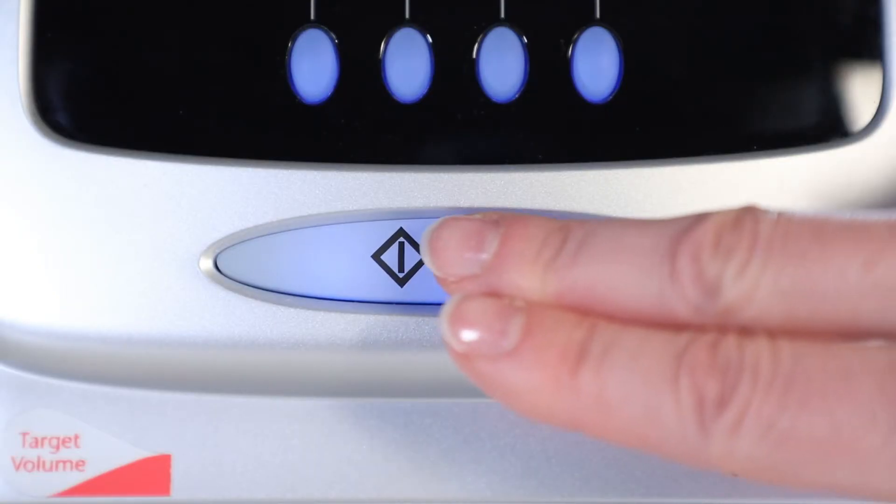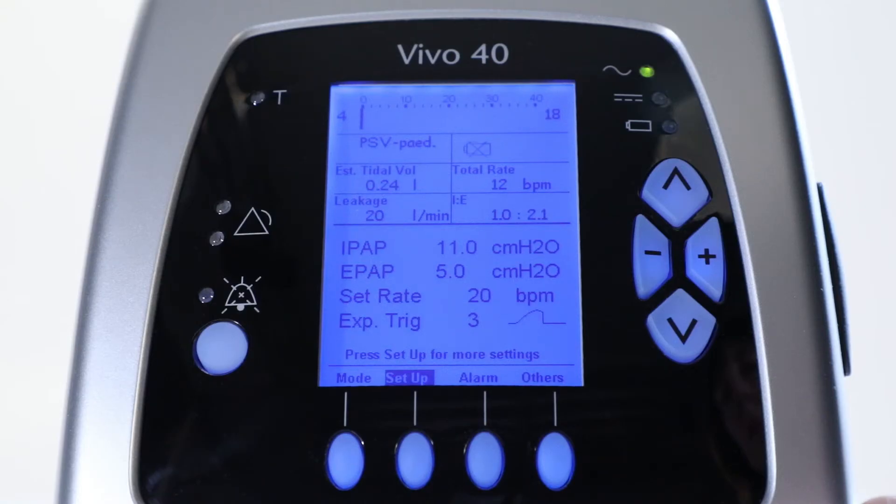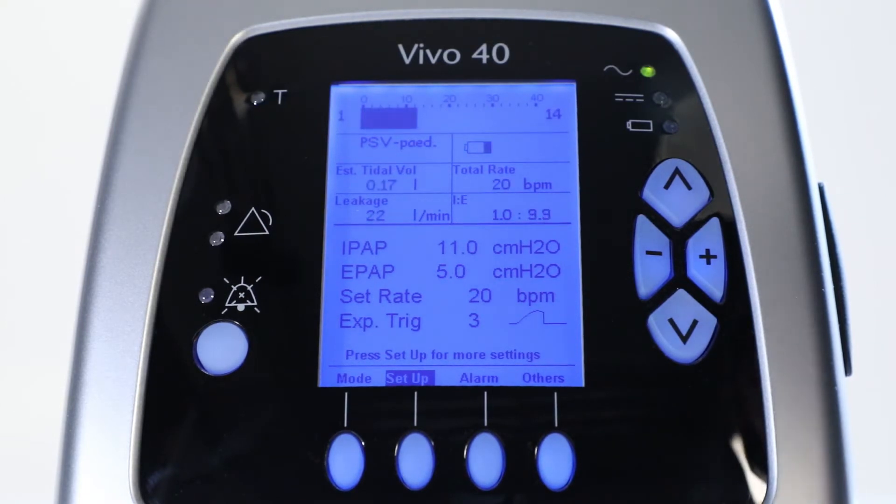Press the Start-Stop button on the front panel for 2 seconds. A short sound signal must be heard. If not, don't use the ventilator.